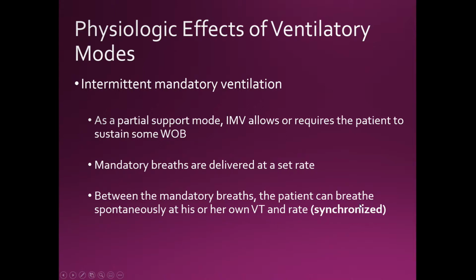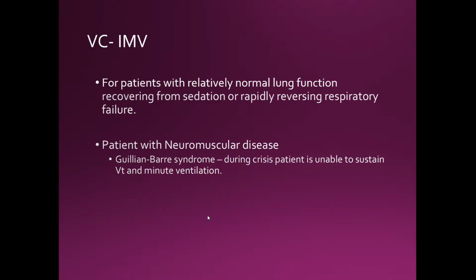So that's where the synchronization comes into play. So if they breathe in, let's say at second number 5, on the 5th second, when they're supposed to breathe at the 6th, then it will adjust based on the patient's last breath. So that's the good thing about IMV when it's synchronized. Okay, so if we're volume control IMV, same thing applies.